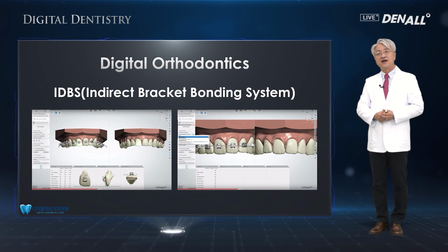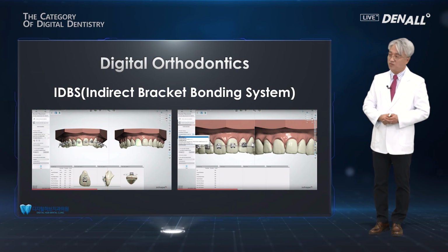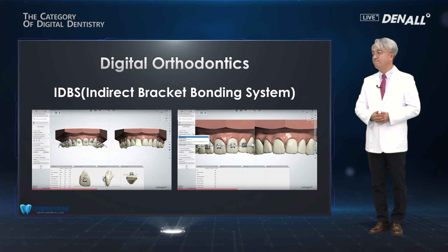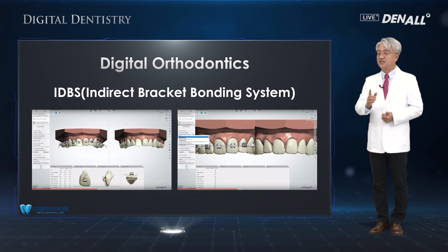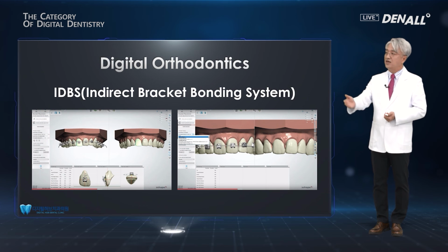Now I talked about the zirconia crown. Now in the digital dentistry category, you not only do prosthesis but also orthodontic works. So let me explain about orthodontics with the digital approach. Here, digital orthodontics is possible mostly with the setup, and teeth analysis using calipers or tape measures. You had to use those tools, but now it can be done automatically.